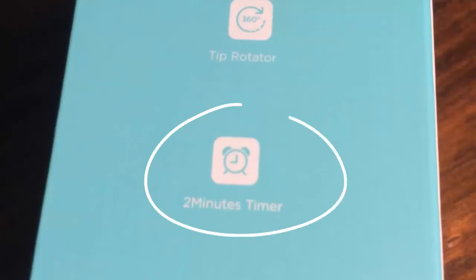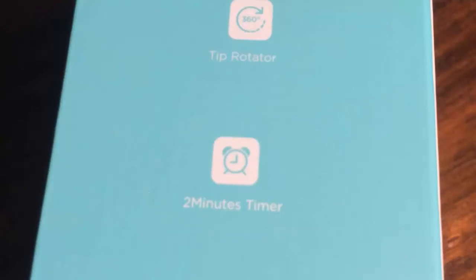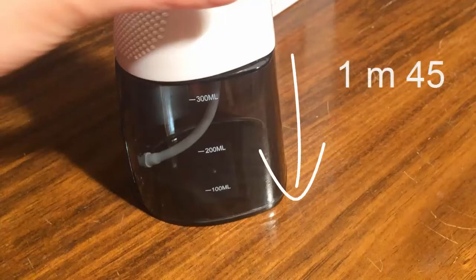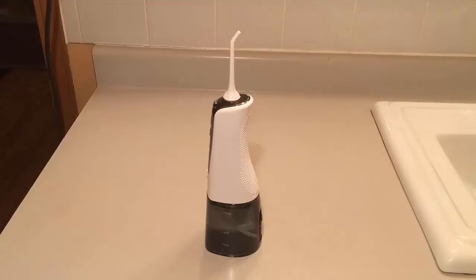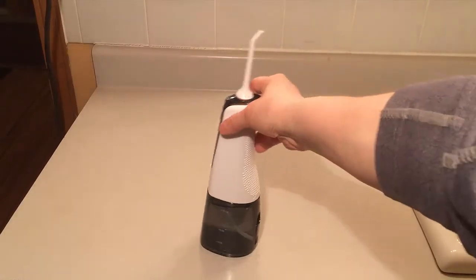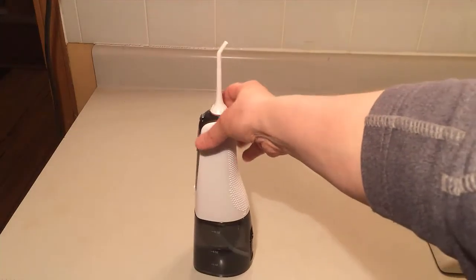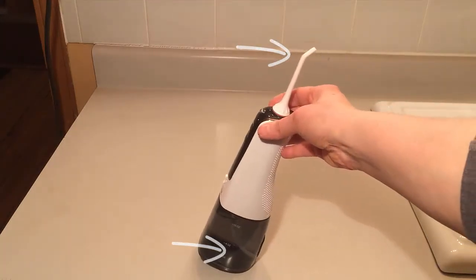Also, the timer mentioned isn't one that you can manually set. It's just an inbuilt mechanism that stops the motor after 2 minutes of continuous use. However, it is quite useless with normal speed as it will take less than 2 minutes to empty a full reservoir. The rotating tip might sound like something that's practical, but I've noticed that if I don't keep it in the same direction as the pump, I catch air quickly as I'm flossing.